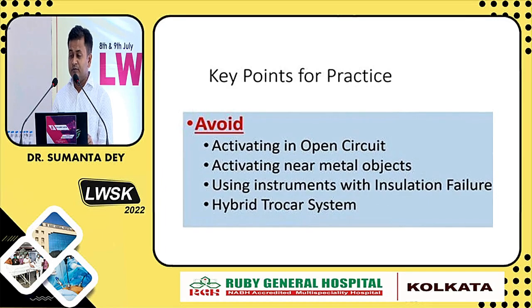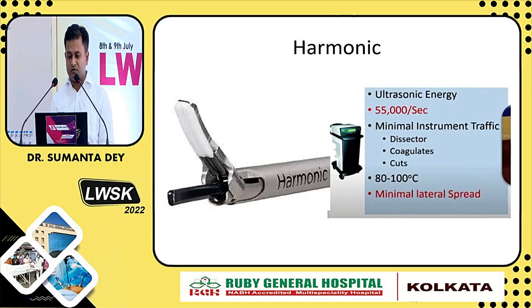Avoid what should be avoided? Activating in open circuit. If your laparoscopic instrument, suppose the hook, is not in use and you are pressing the pedal, it can injure the outside of the patient's body. The energy can go through the drape, and there can be skin burns. So that should be avoided. It should not be activated near any metal object. I have described using an instrument with insulation failure, and the hybrid trocar system, that is the plastic trocar cannula. Then there are mechanical energy sources.